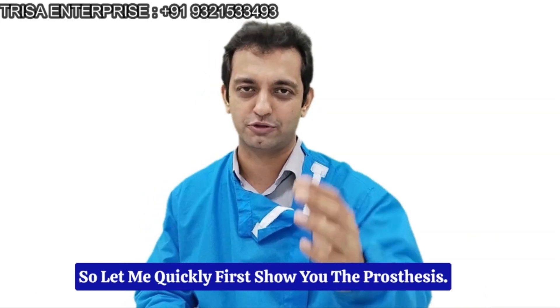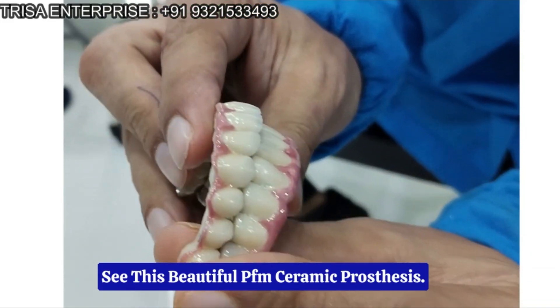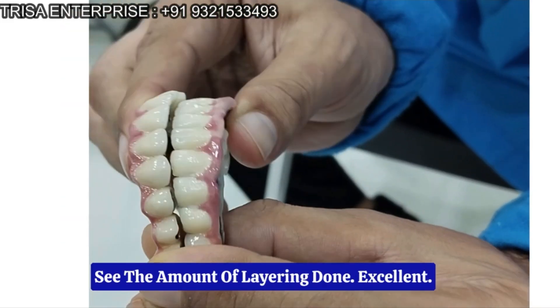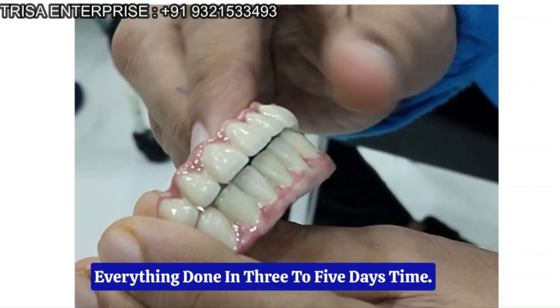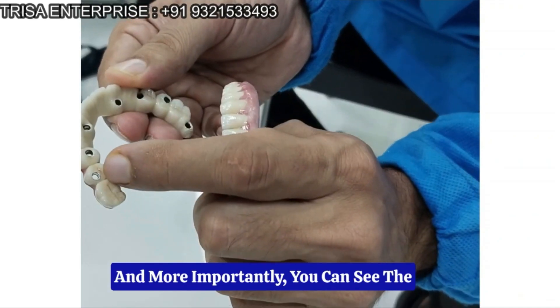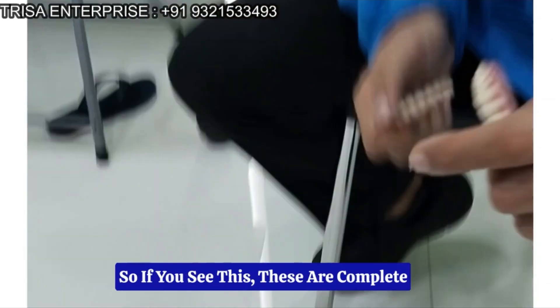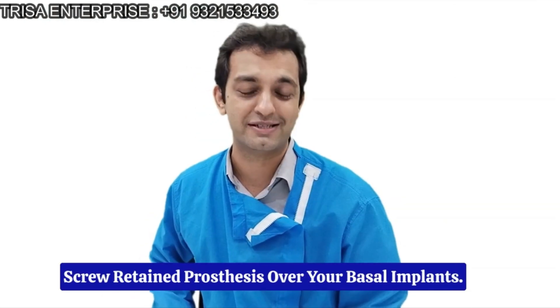So let me quickly first show you the prosthesis — just come closer. See this. Beautiful PFM ceramic prosthesis. See the amount of layering done. Excellent — everything done in 3 to 5 days time. And more importantly, you can see the screw hole retained prosthesis over here. This is a complete screw retained prosthesis over your basal implants.